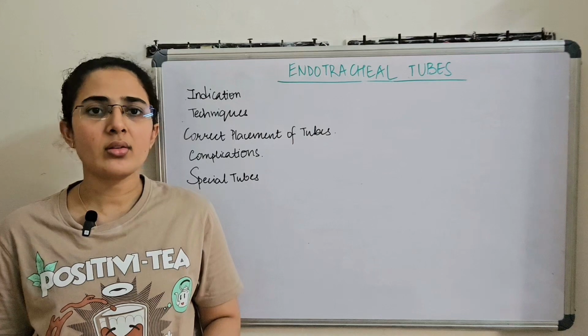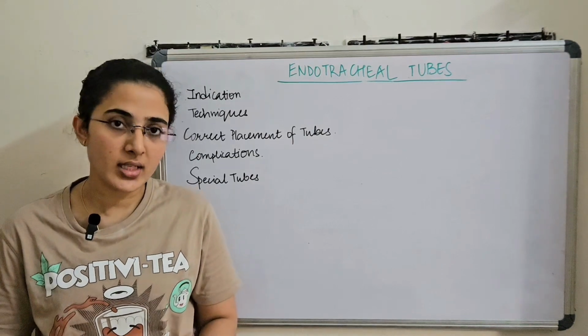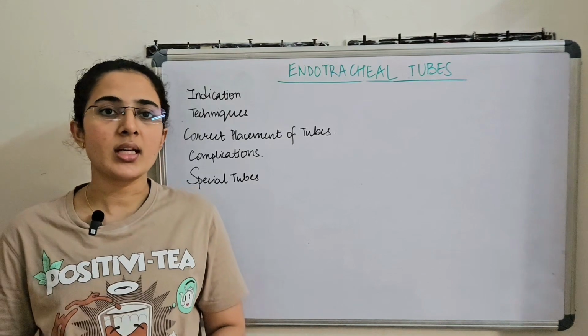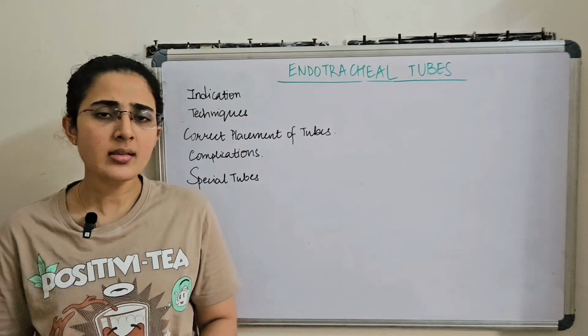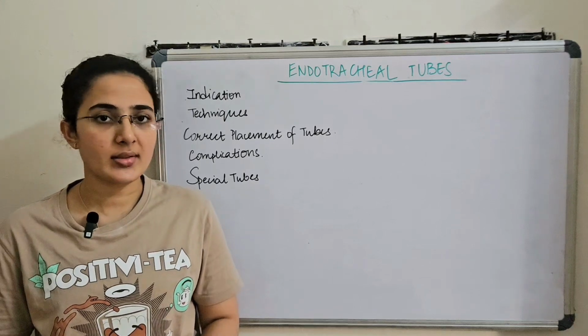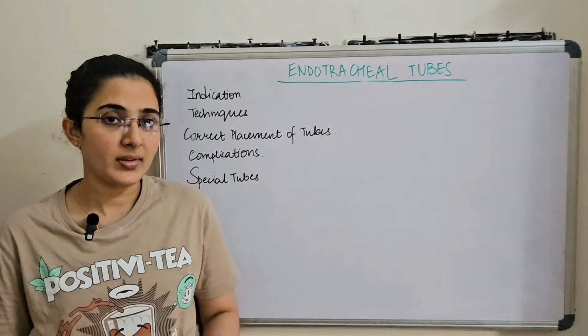Indications where nasal intubation specifically will be required are some head and neck surgeries, or surgeries involving the temporomandibular joint or mandible, etc. So these are some indications for nasal intubation, but these are elective indications.